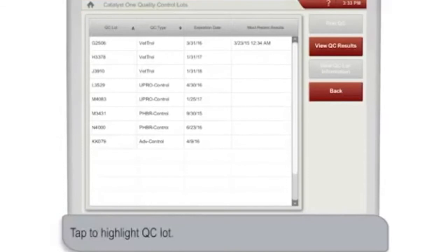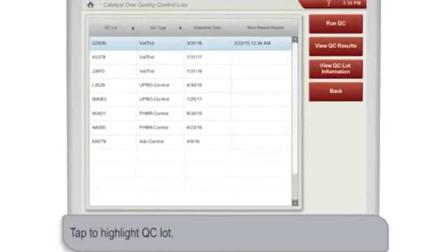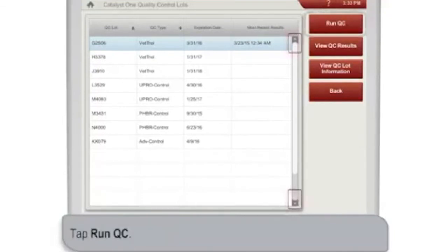Select the quality control lot number you're using. You may have to scroll to find the appropriate numbers using the up-down arrows on the right, and then tap Run QC.